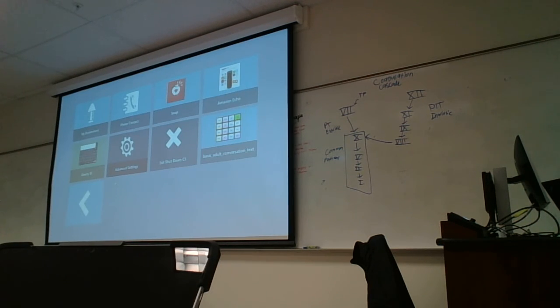And then the other thing we'll take a look at, like I said, with the devices is access to them outside of the communication software. So devices that are generally covered by a funding source, such as insurance, Medicare, and Medicaid, are what's called locked devices. So you have the ability to do updates to them, but anything outside of the speech communication page or communication software, they do not have access to.